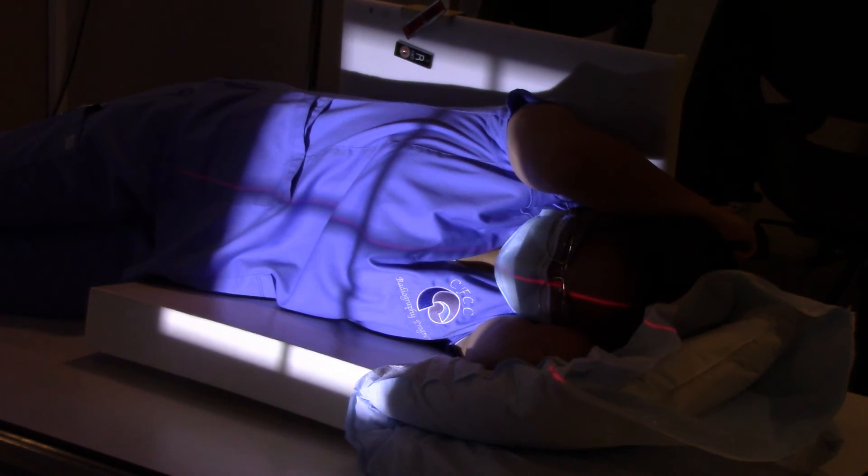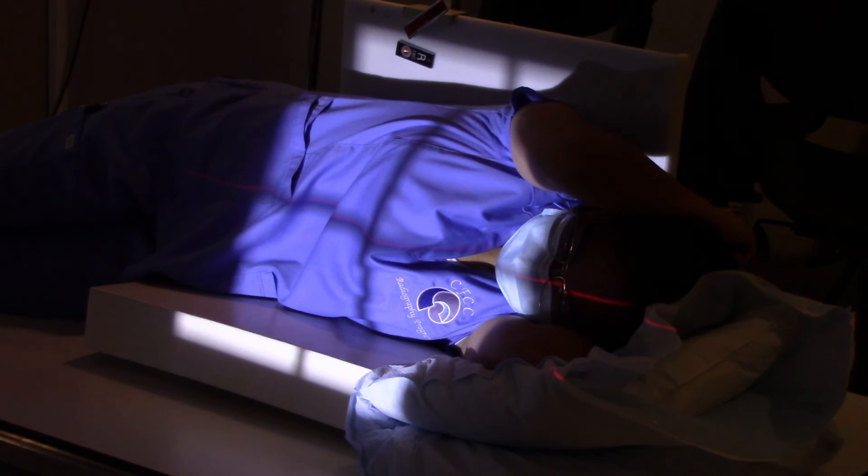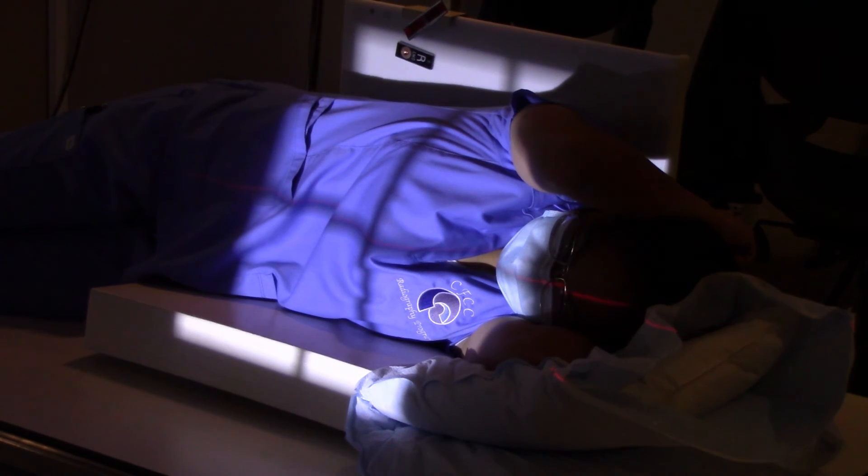Any breathing instructions? Okay, I was going to check because it moved up a little bit. You ready? Breathe in — big — hold. That's it. And you can relax.